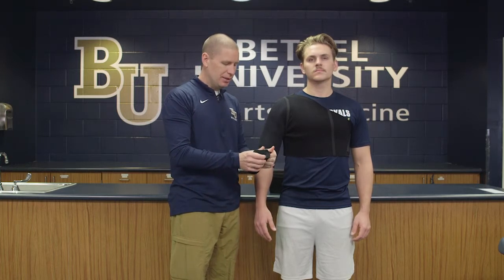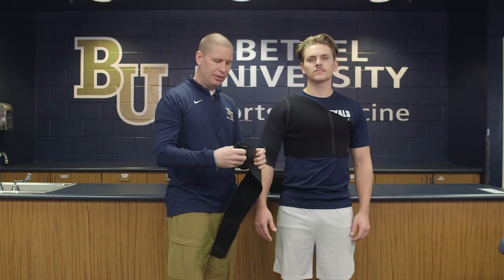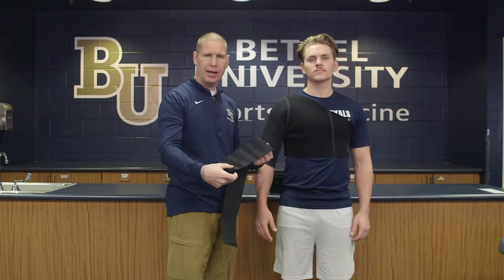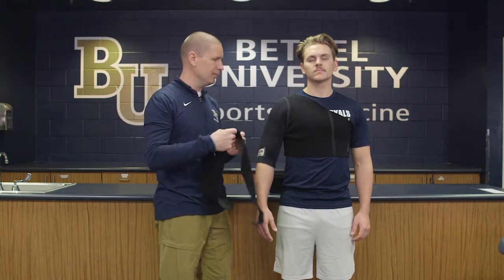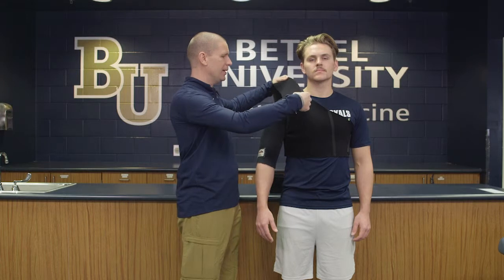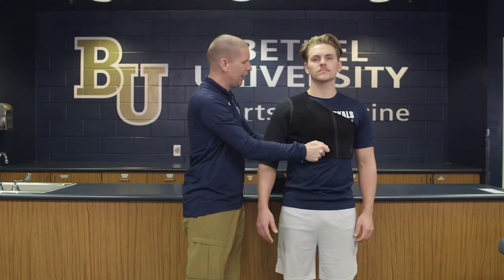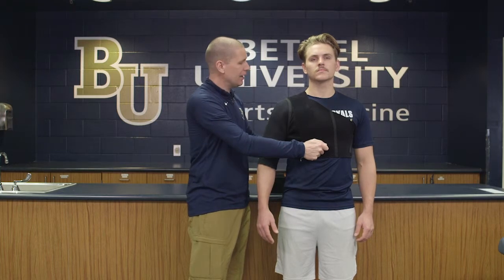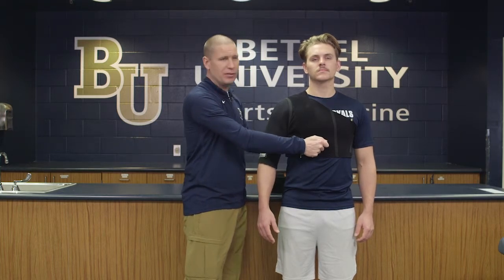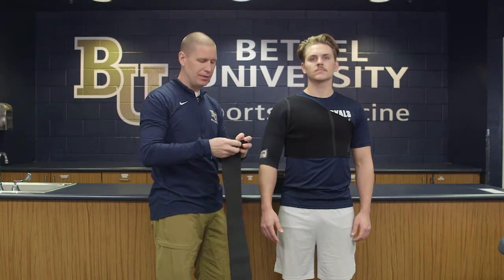For example, this particular strap is a little wider and smaller — all of these straps are designed to be cut to whatever size you need. Some individuals have issues with their clavicle, so we can actually take this, secure it, and pull it down to hold the clavicle down. That's a simple alternative thing you can do, just as an example.